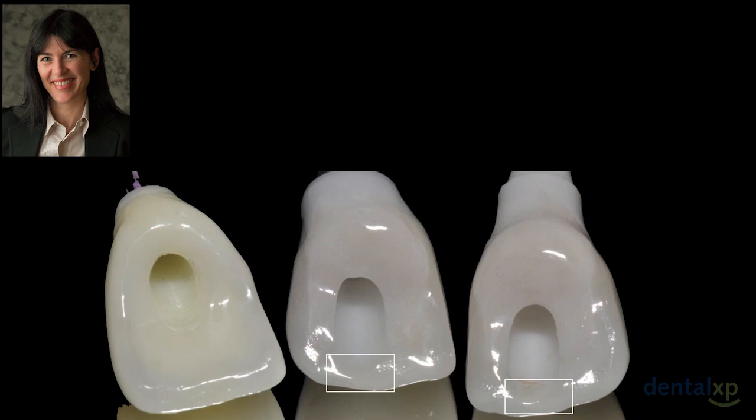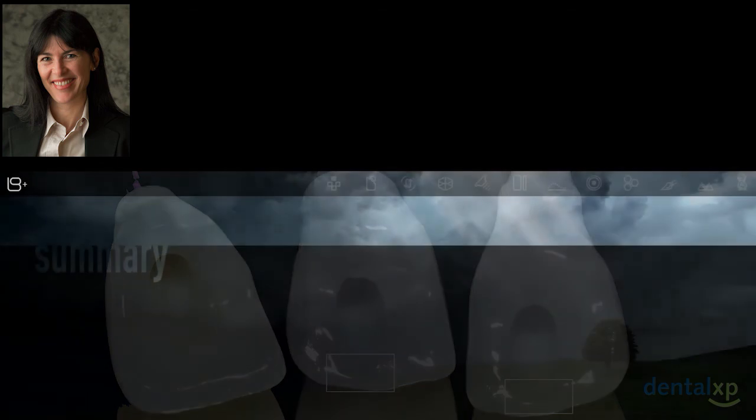But what I thought was screw retained is not always screw retained, because in the 2 cases where I show you with a little box there, the problem there is the ceramics cannot characterize the ceramics in that area because I'm too close to the incisal edge. So it forces me to be much more careful in my treatment planning and where I'm actually putting my implants.